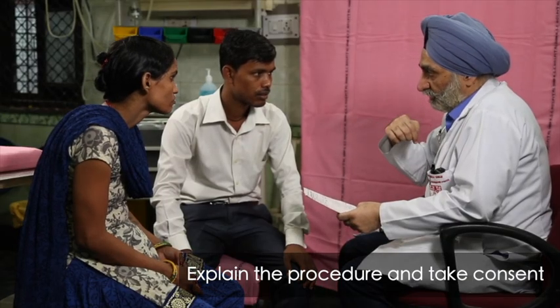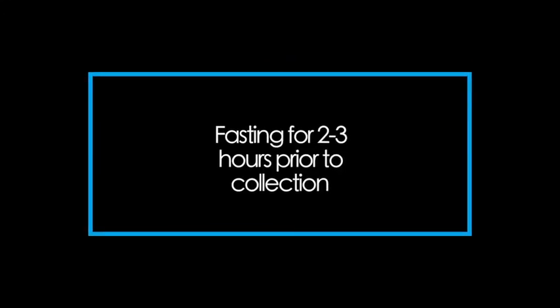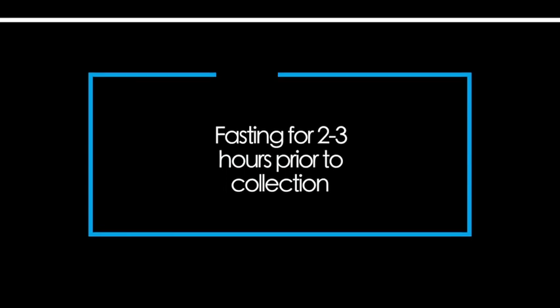Explain the procedure and take consent from the parent or guardian. The patient should be fasting for 2 to 3 hours prior to the collection procedure.